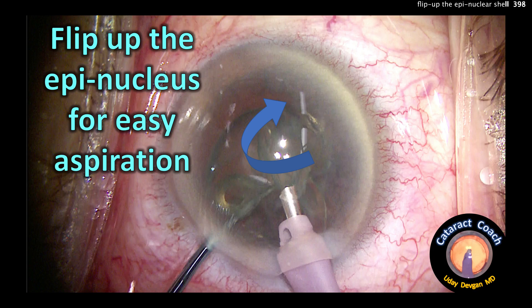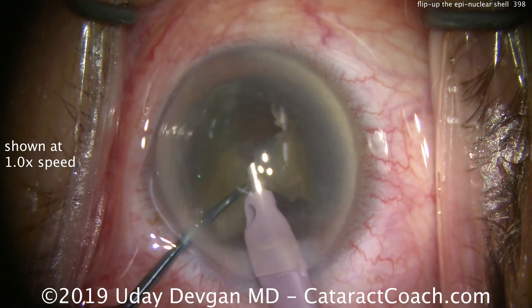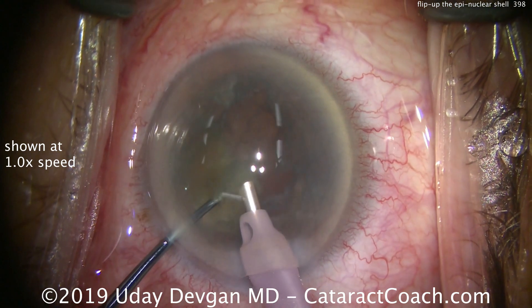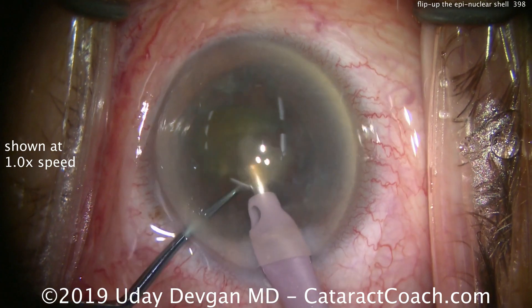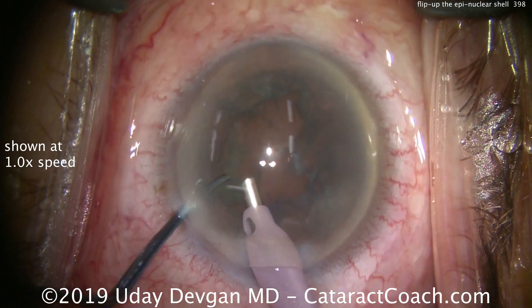cataractcoach.com — flip up the epinucleus for easy aspiration. Let me teach you this technique; it's very important. At the end of nucleus removal, there are just a few small pieces of nucleus left. Here's one piece, and here's the last quadrant of the nucleus. We'll take that out, and what we're left with is an epinucleus shell in the capsular bag.